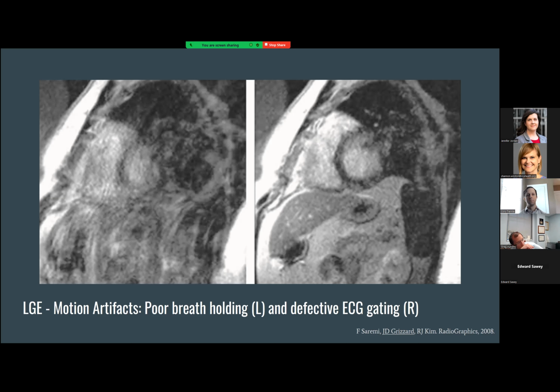And that then decreases the number of K-space lines that are required to fill the K-space matrix. And then you don't have as long of a scan because you're collecting less data, and that might help shorten the breath hold and get you some diagnostic quality back.